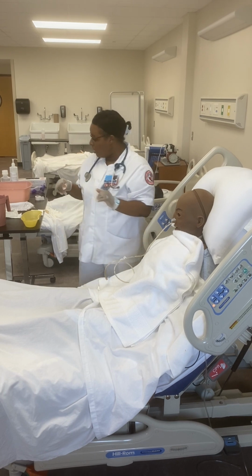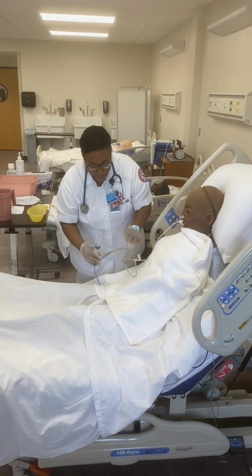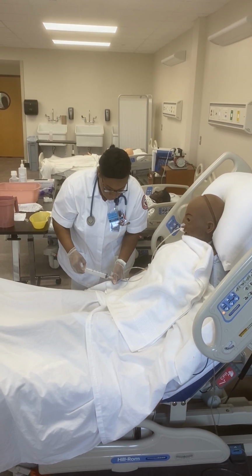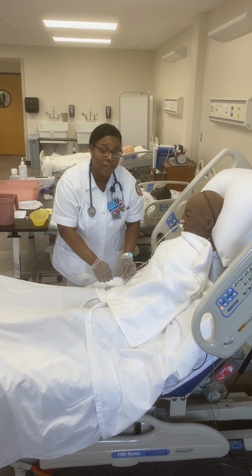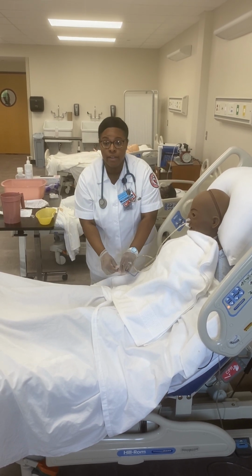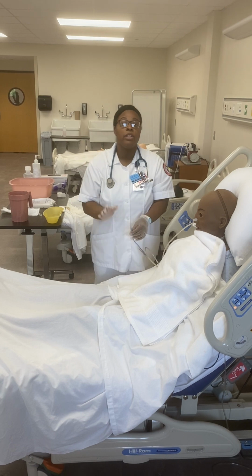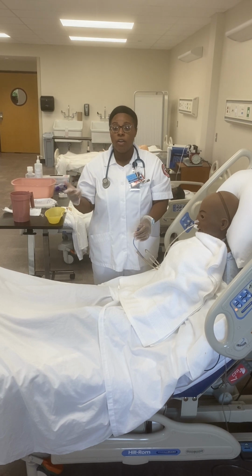Now I'm going to verify placement by aspirating gastric contents and checking the pH. You can also check placement by chest x-ray. And once placement has been verified, I'm going to hook up to the suction or to whatever orders the doctor has, like feeding or whatever orders.